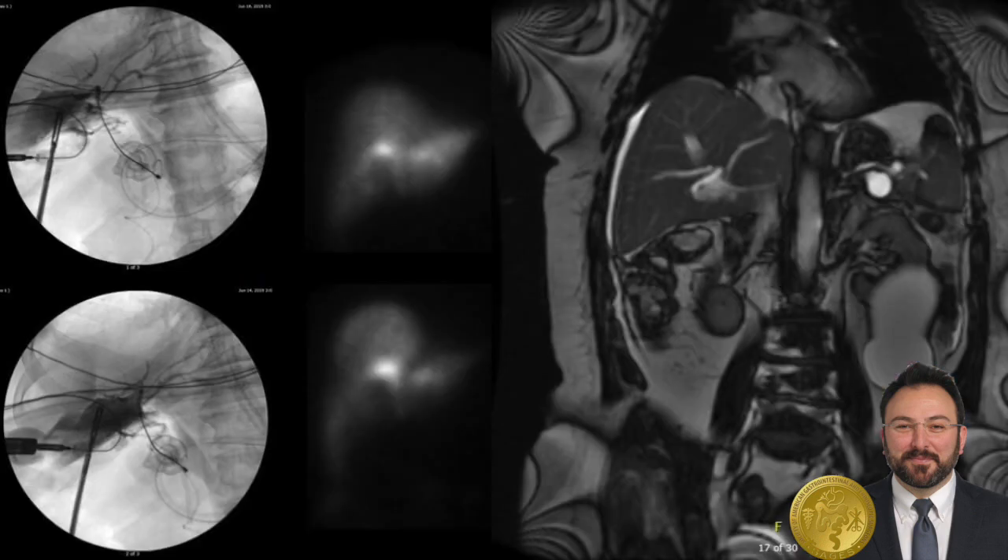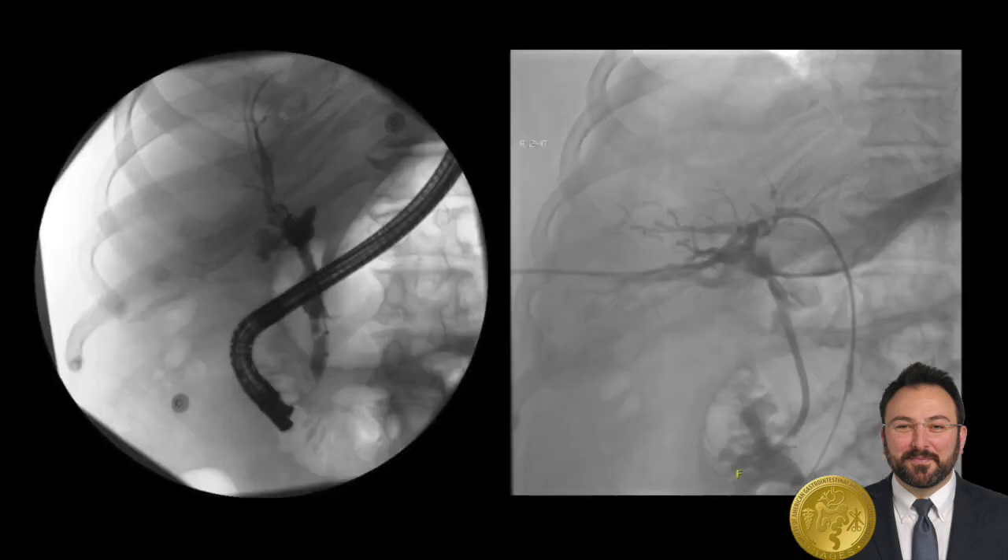The intraoperative cholangiogram is shown here on the left of the screen. You can see that no contrast makes it to the duodenum and it's very difficult to see any part of the common bile duct. Post-operative HIDA study showed a significant leak from the gallbladder fossa, and post-op MRCP showed complete loss of the duct approximately at the bifurcation. The patient was transferred to us on post-op day two, and an ERCP was performed, which demonstrated free contrast extravasation into the intraperitoneal cavity, and the wire was not able to engage the biliary system.